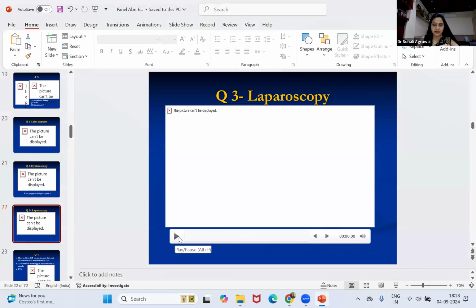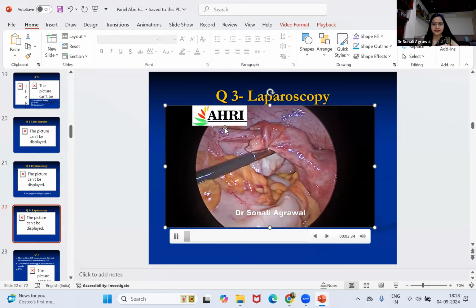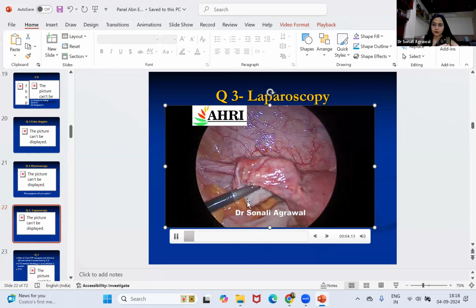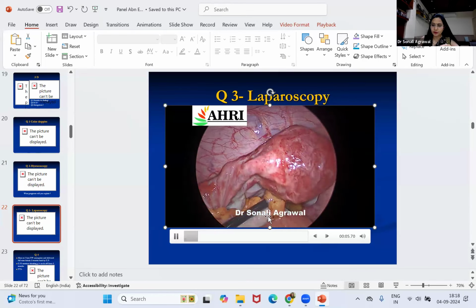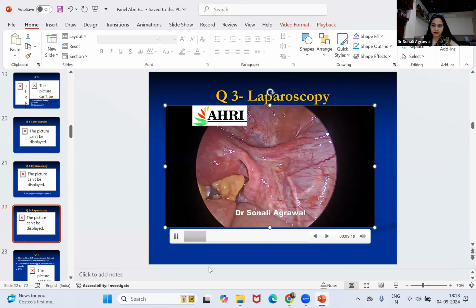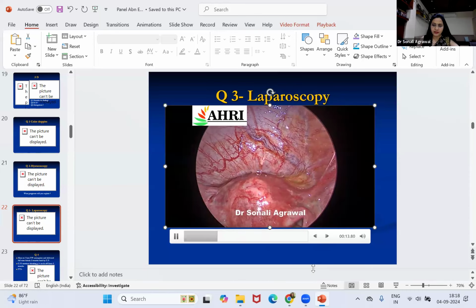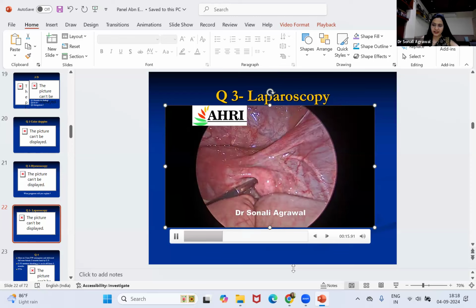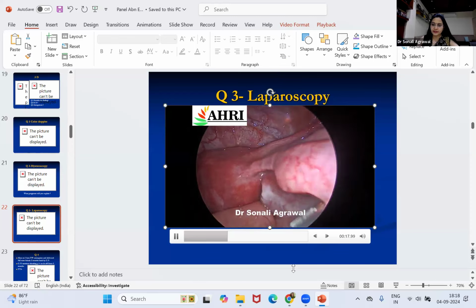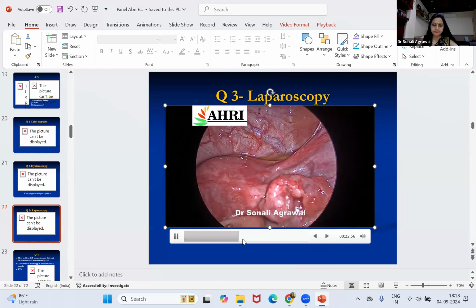Exactly. And on laparoscopy, the tube was adherent because of previous cesarean or PID. So we did fimbrioplasty in that patient. The right tube was free, the left tube was adherent to the pelvic wall. We did an adhesiolysis. This is a normal tube.